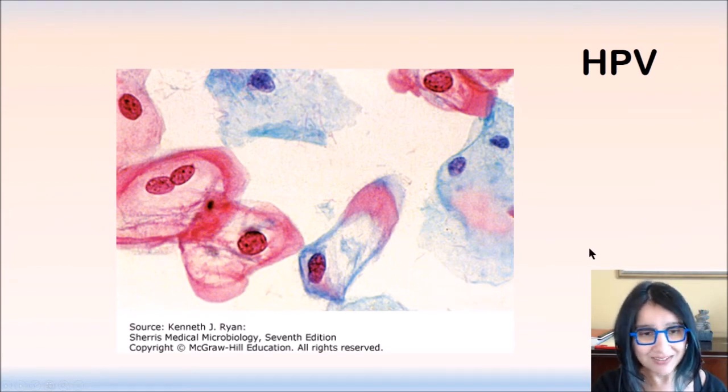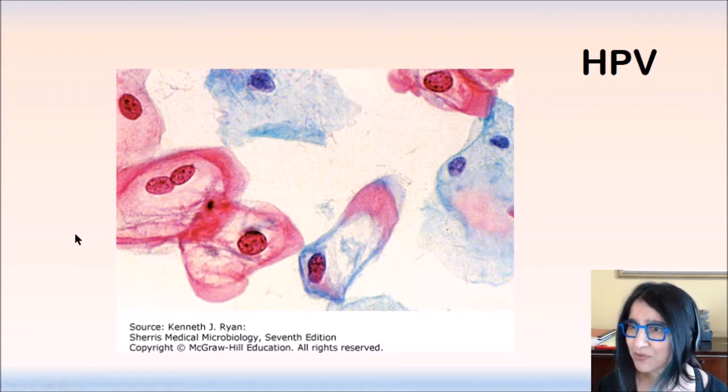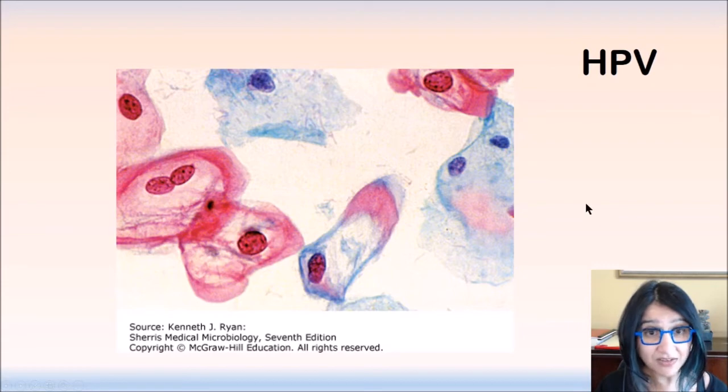All right, moving along to papillomavirus, human papillomavirus. This pap smear shows you the classic haloing. It also shows you this little multinucleation here, all characteristic of HPV. The pap smear, if you think about it, was just so ideally suited to identify these cellular abnormalities, these pre-neoplastic conditions. So we're very lucky that we had that modality that was discovered to help us identify this particular viral infection.